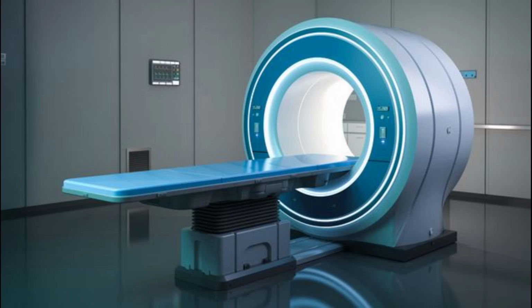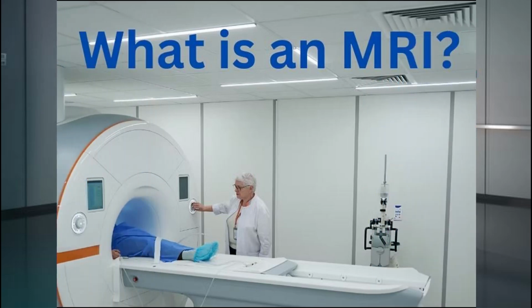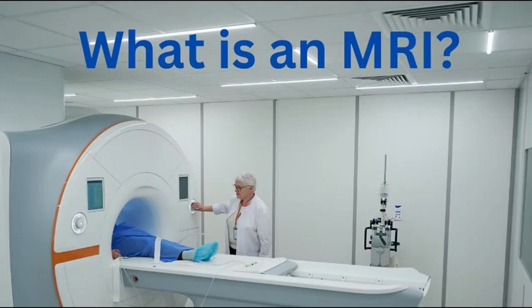MRI, or magnetic resonance imaging, has revolutionized the way we view and understand the human body. Unlike other imaging techniques, MRI does not use ionizing radiation, making it a safer option for many patients. In this guide, we'll explore the science behind MRI, its various applications, the benefits and risks, and what you can expect during an MRI procedure.